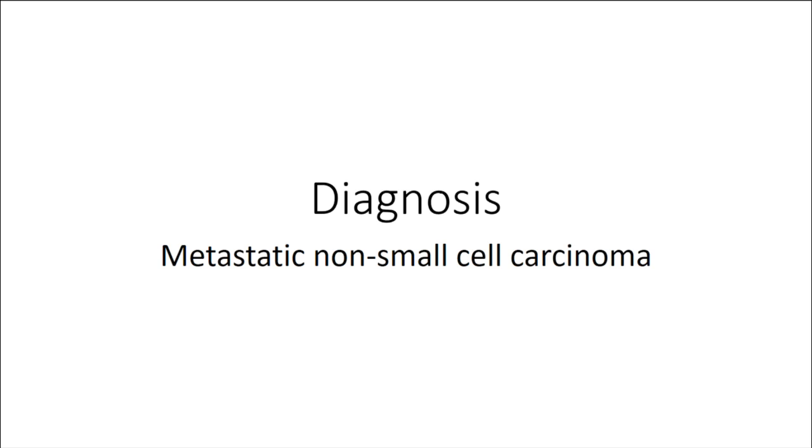So that's something to have in mind, that when you have something that looks for sure atypical, you can have papillomas in adults, and I showed you some that occur in even somewhat older patients. But when you start having something that you're concerned is malignant, you're most likely going to be dealing with metastasis to the choroid plexus. And it makes sense, since the choroid plexus is actually a very vascular organ.